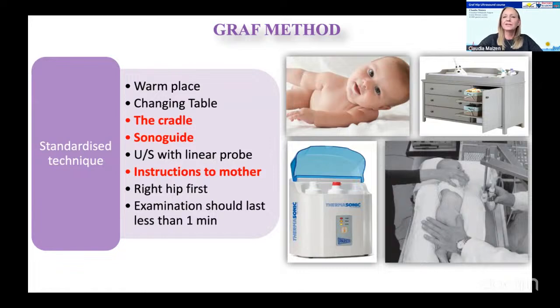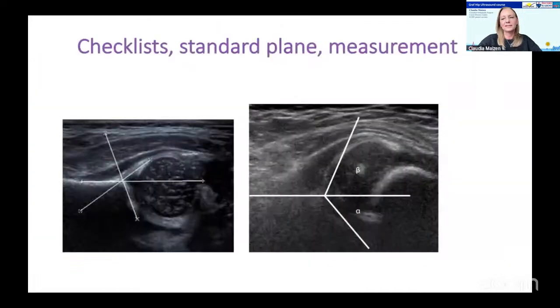The whole technique is essentially aiming to make this ultrasound examination as quick as possible, because we're racing against time. There's only so long that this baby is going to keep still and allow you to move your ultrasound probe on it. As soon as the baby starts to move or cry, you're pretty much lost, because you won't be able to see all these structures very nicely that you want to see. So it is a very standardized approach, from the setup to the picture quality and measurements, description, etc. We've heard the checklists, we heard about the standard plane and measurement.